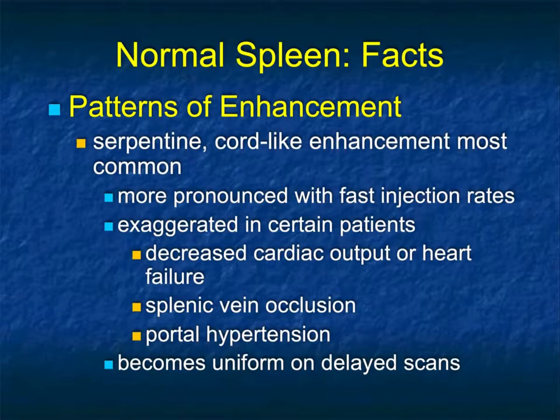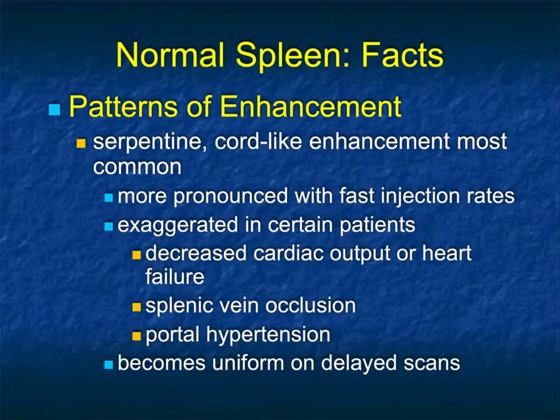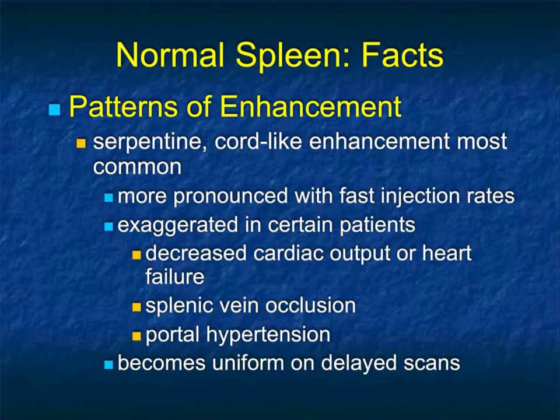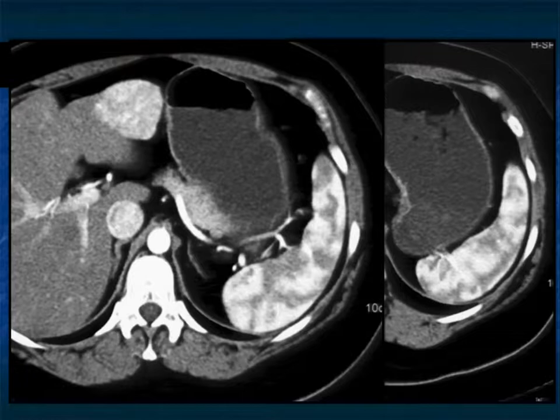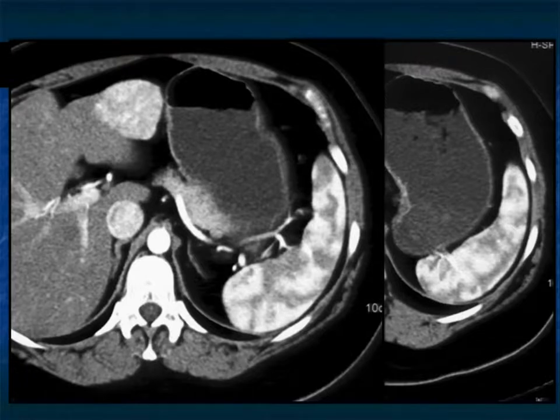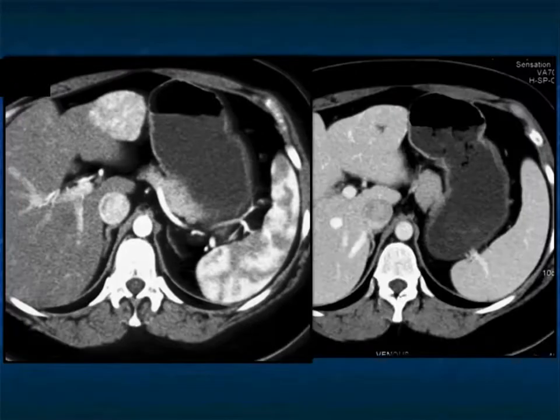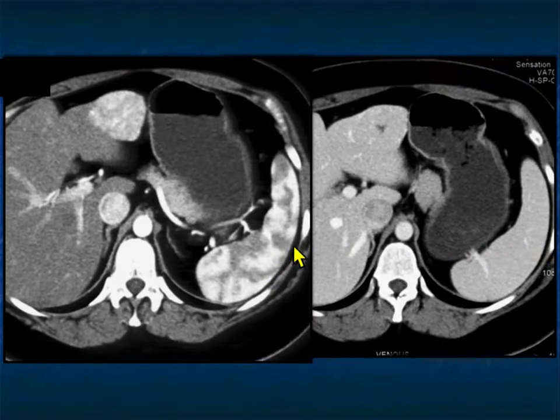Splenic enhancement shows a serpentine, cord-like pattern most commonly — this mottled or moray pattern is seen with faster injection rates and can be exaggerated in patients with decreased cardiac output or heart failure, splenic vein occlusion, or portal hypertension. The moray pattern becomes uniform and isodense on delayed phase imaging. One of the challenges for new residents is looking at early phase imaging and mistaking the moray pattern for splenic laceration. A normal spleen will show this pattern on early phase, then become homogeneous on later phase — there's no splenic pathology; it's a normal spleen.